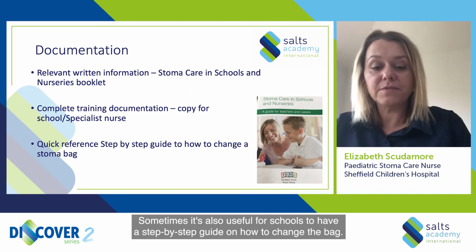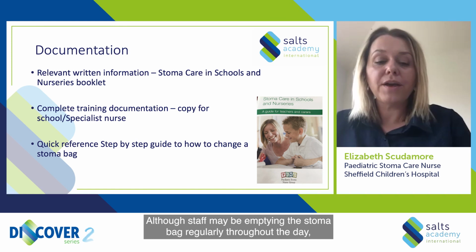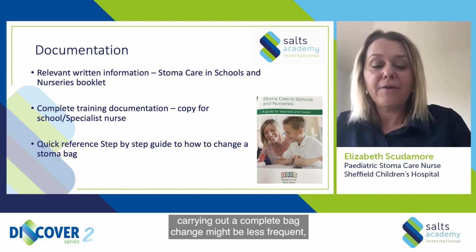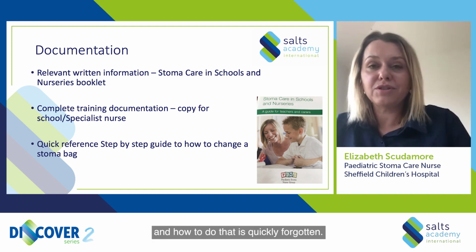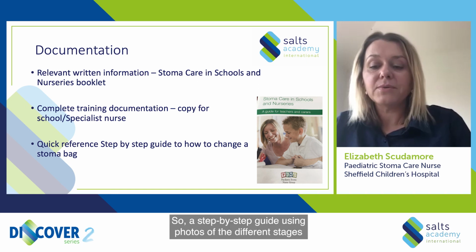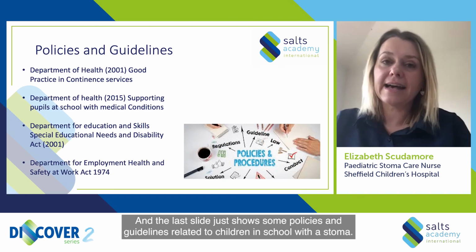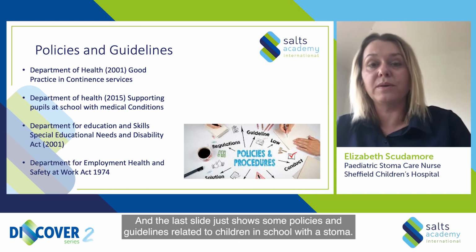Sometimes it's also useful for school staff to have a step-by-step guide on how to change the bag. Although staff may be emptying the stoma bag regularly throughout the day, carrying out a complete bag change might be less frequent, and how to do that's quickly forgotten. So a step-by-step guide using photos for the different stages can help jog people's memory. And the last slide just shows some policies and guidelines related to children in school with a stoma.